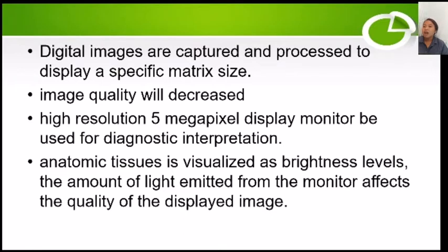Digital images are captured and processed to display a specific matrix size. An image created with a large matrix having many smaller sized pixels improves the spatial resolution of the digital image. If the monitor used for viewing the digital image cannot display a matrix of that size because it has too few display pixels, then the image quality will decrease.